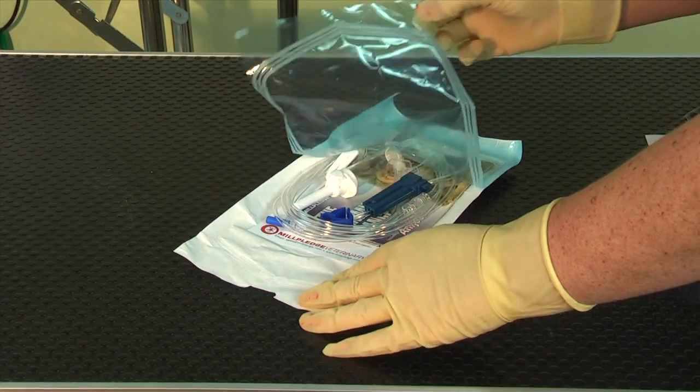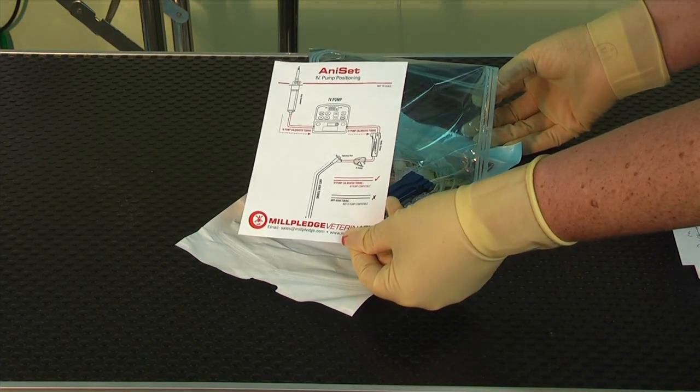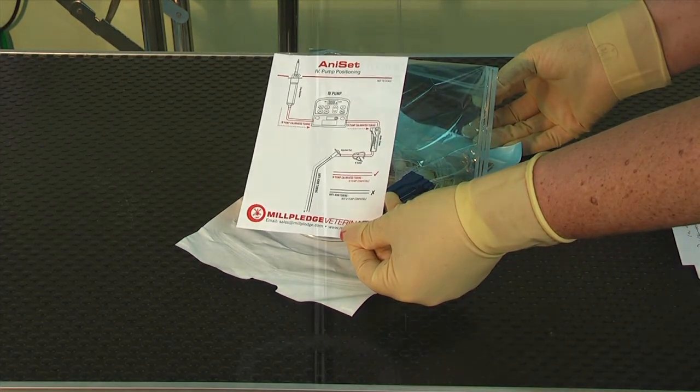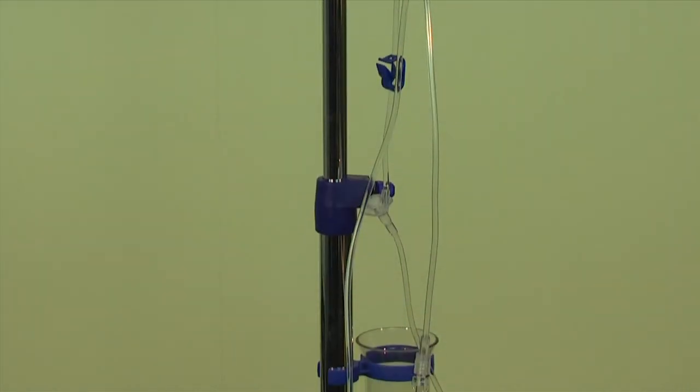In each AniSet IV pack, you will have a diagram to show you how to place your set within an IV pump. Prime the AniSet ensuring all air bubbles are out of the line.